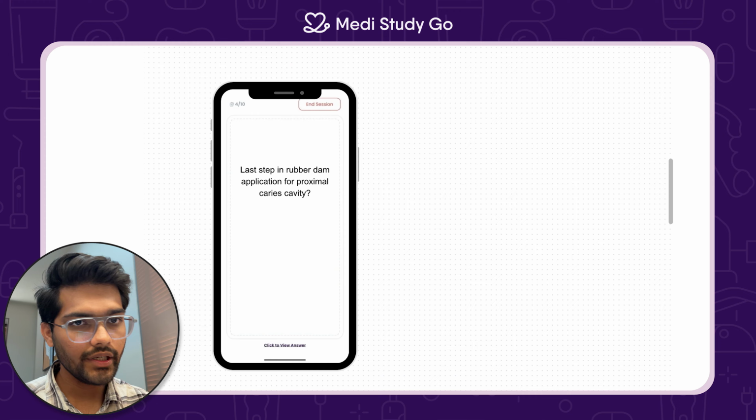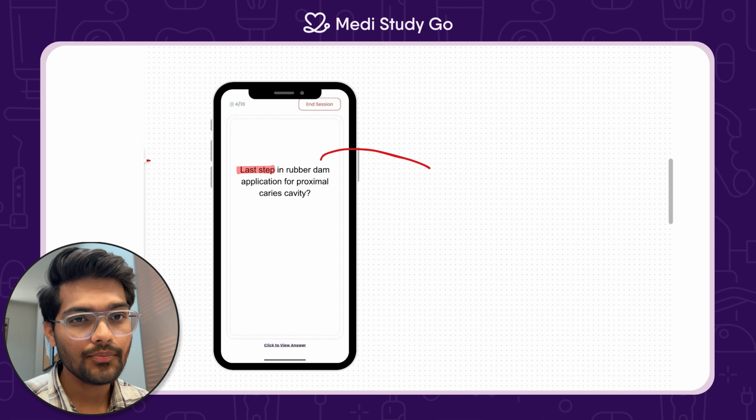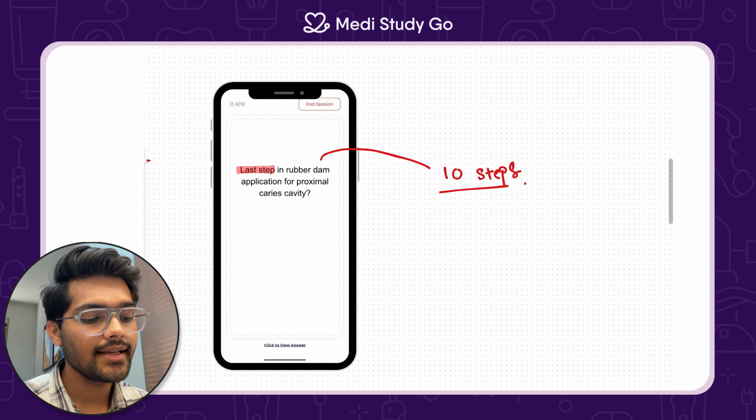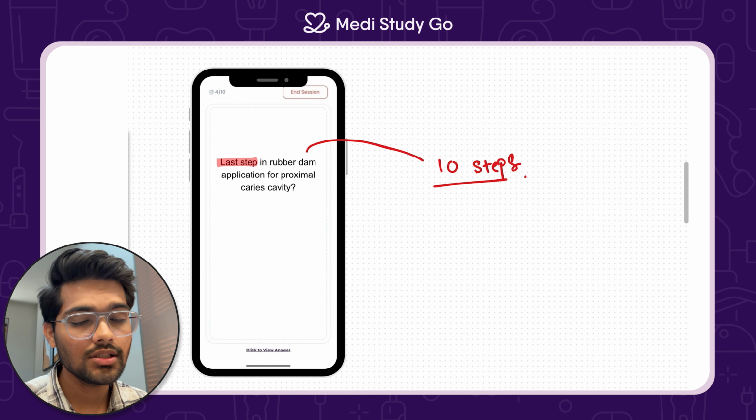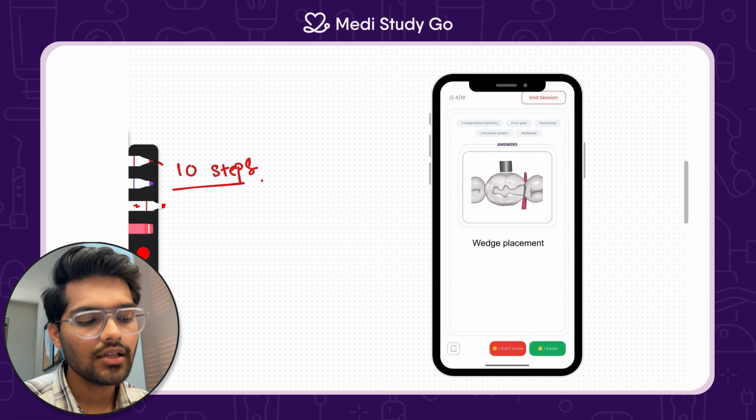So once again, we are going to quickly revise with the help of a few questions. This question is, what is the last step in rubber dam application for proximal caries cavity? We have already studied that there are 10 steps in rubber dam application. You just need to write down the last step, and the last step is wedge placement.